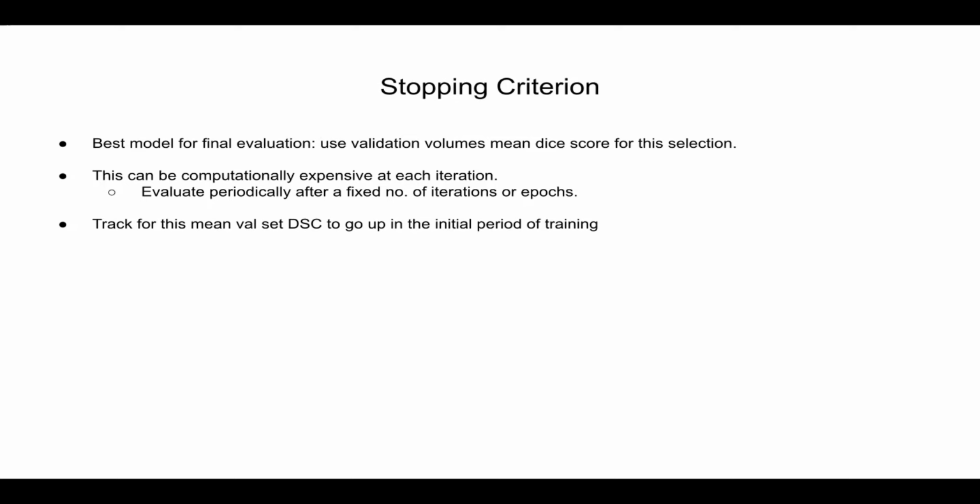And coming to the visualization, I think it's also important to track this mean dice value. And we should observe that this goes up during the initial part of the training.